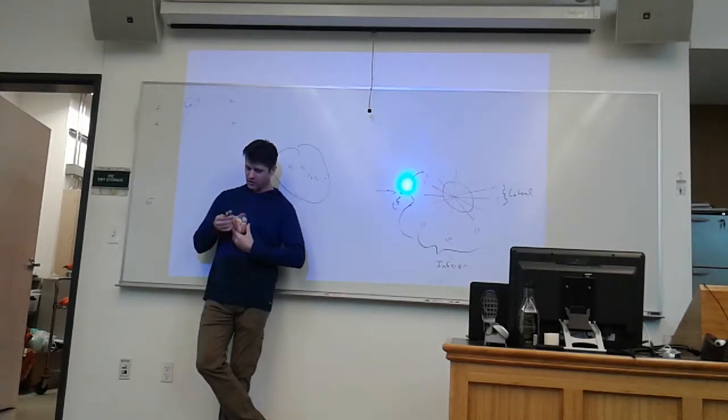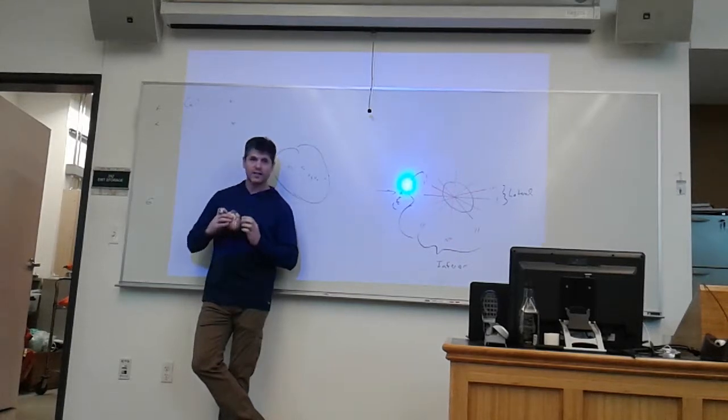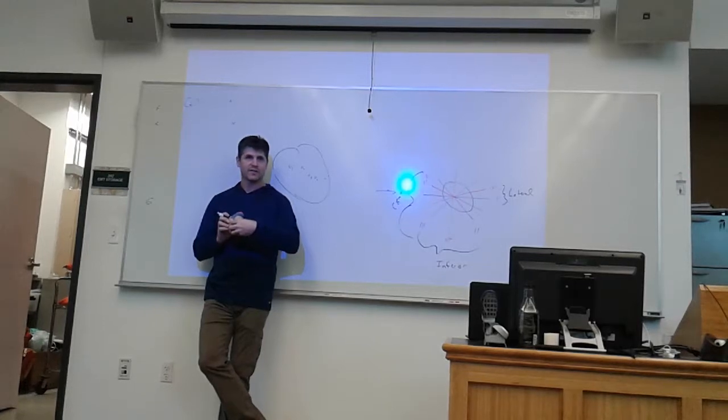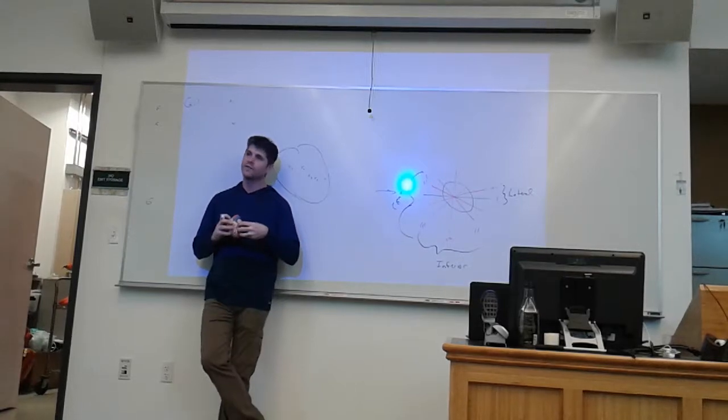So we're actually looking directly at the right side on V1, where it sees the septum and it sees the right ventricle. V2 is over here, where it sees primarily the septum and maybe a little skosh of the right and a little skosh of the anterior. V3 and V4 look at the anterior of the left ventricle. If this were shifted back, that would be the anterior. So you have to understand the orientation of the heart. V3 and V4 look at the anterior portion of the left ventricle.